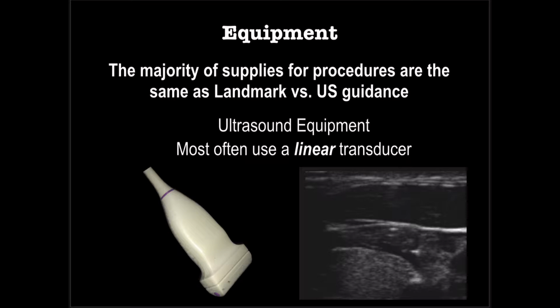I didn't tell you this when we were talking about physics, but the higher the frequency, the better resolution you have. So you'll be able to see parts of superficial structures a lot better, like the parts of the artery. And you'll also be able to see your needle tip much better as it comes into this vein or artery. The bad thing about high frequency is it doesn't image very deep. This is why we can't use it on the abdomen, because we wouldn't ever be able to see anything inside the abdomen. We'd only be able to see the abdominal wall.